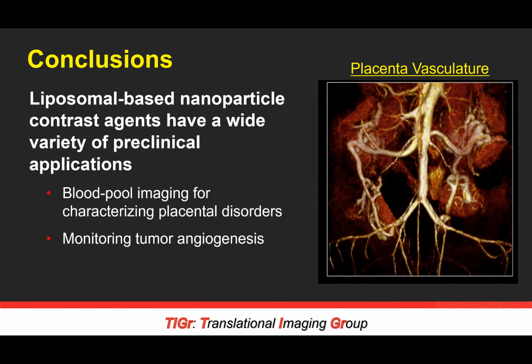So with that, I'd like to conclude my presentation, so that way we have plenty of time to go through questions. In conclusion, we've demonstrated these liposomal-based nanoparticle contrast agents have a wide variety of preclinical applications. We looked at blood pool imaging for characterizing placental disorders, looking at placental vasculature, looking at the retroplacental clear space, and we also talked briefly about looking at tumor angiogenesis and characterizing the tumor microenvironment, both using MR techniques and this contrast-enhanced protocol, both in MRI and CT.